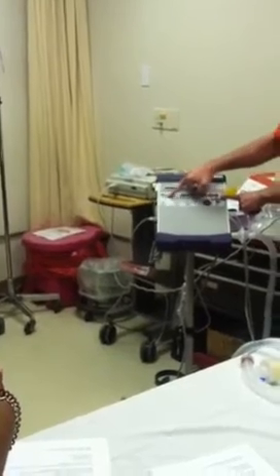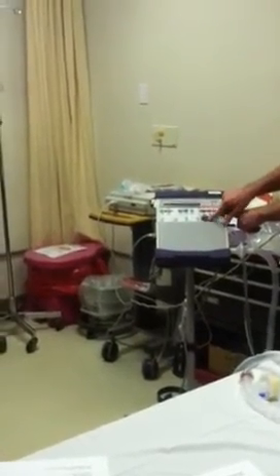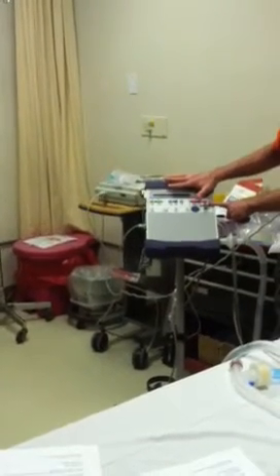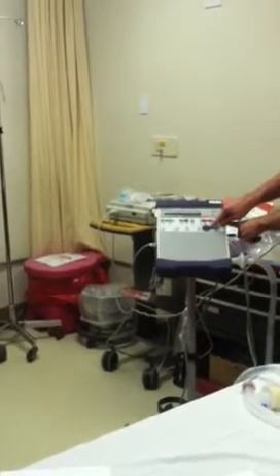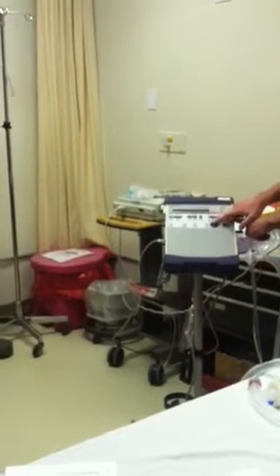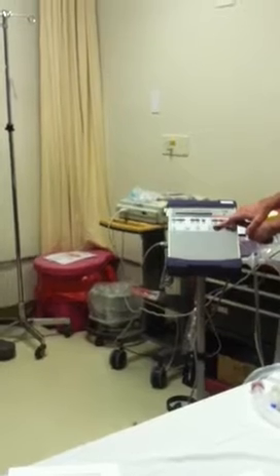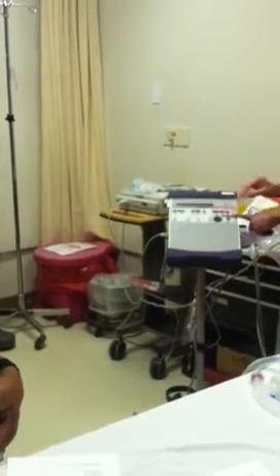Now you see everything else has gone dim, except for the one we'll change. You've got one dial that changes any parameter you want. So I'm going to change the rate, and the doctor says increase them to 14. Let's blow some of the CO2 off. So I put it up to 14, I hit it, everything else comes out.